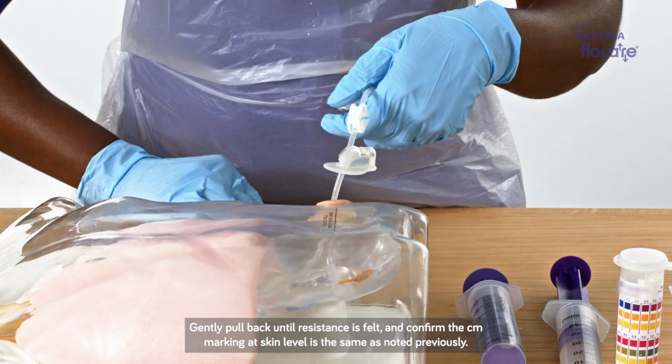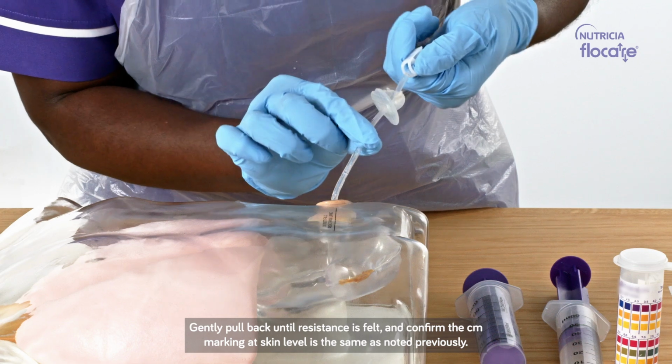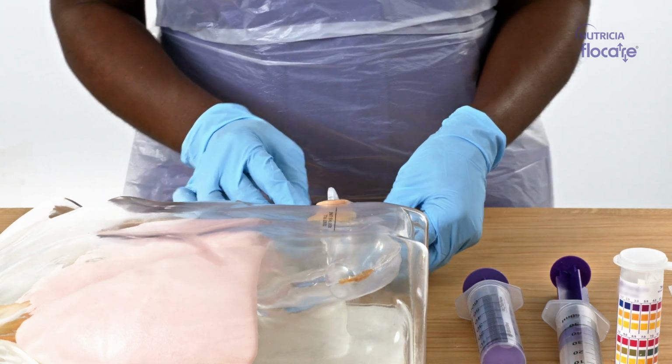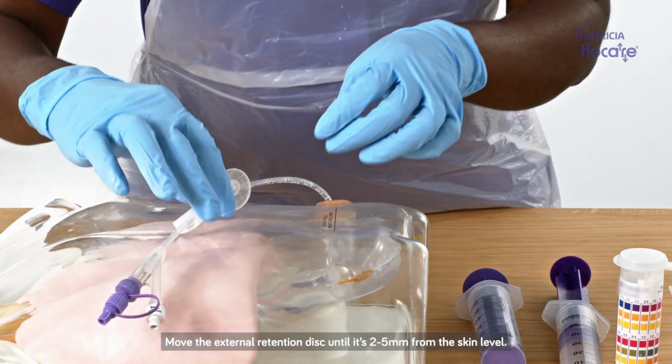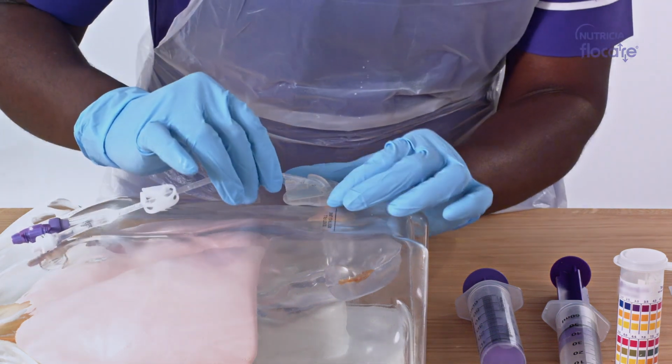Gently pull back until resistance is felt, and confirm the centimeter marking at skin level is the same as noted previously. Move the external retention disc until it's 2 to 5 mm from the skin level.